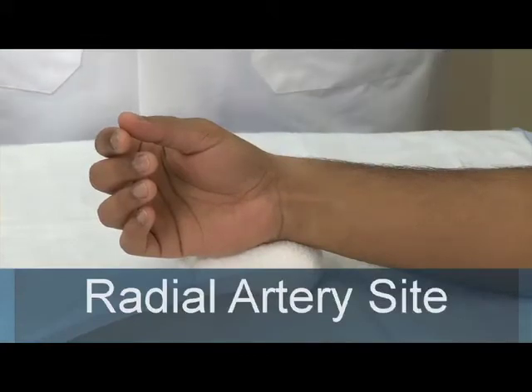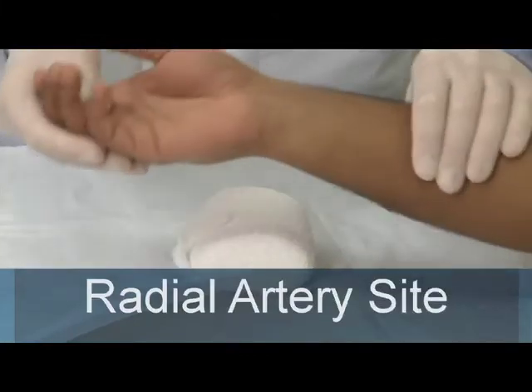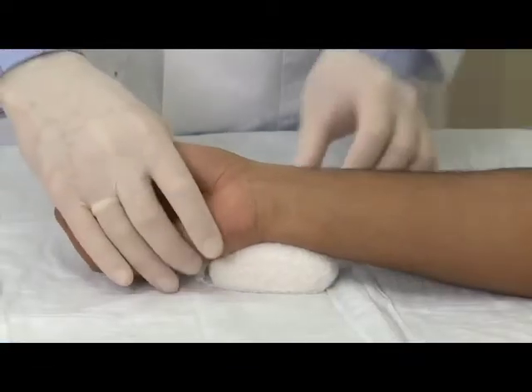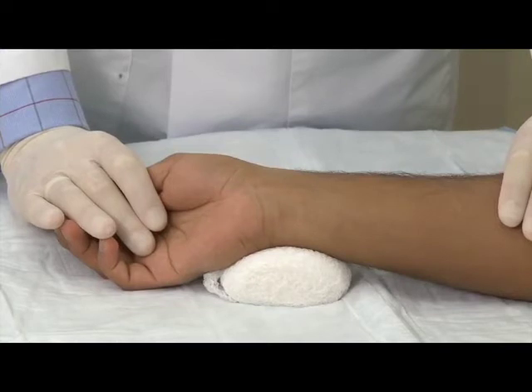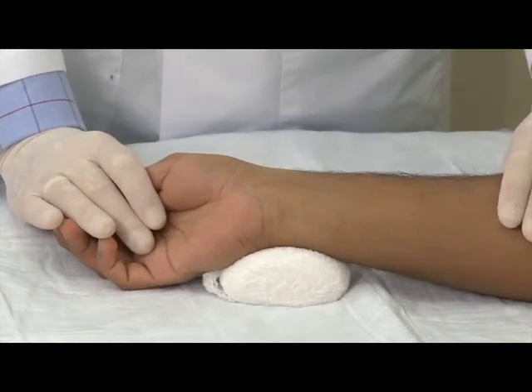For the radial artery site, supinate the arm. Extend the wrist and support this position by placing a towel or similar soft object beneath the extended wrist. You may use an arm board.